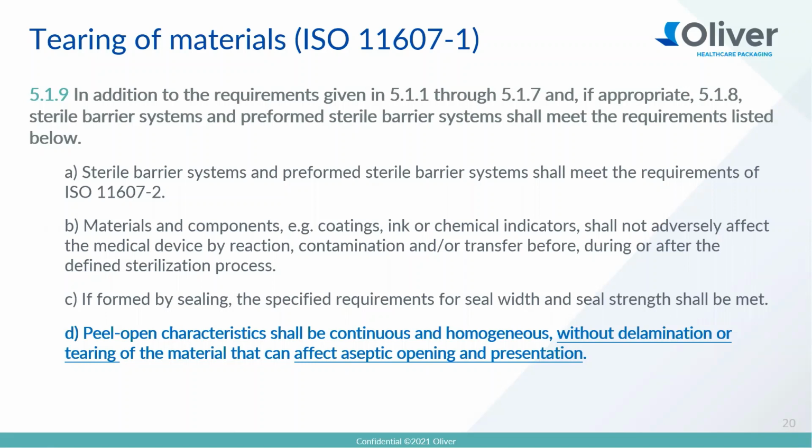Now it's being interpreted in different ways. So a couple of key things that this addresses in ISO 11607 is, one, it recognizes that tearing and delamination happens, but it also, in the end, says when it affects aseptic opening and presentation, that's when it's not allowed.